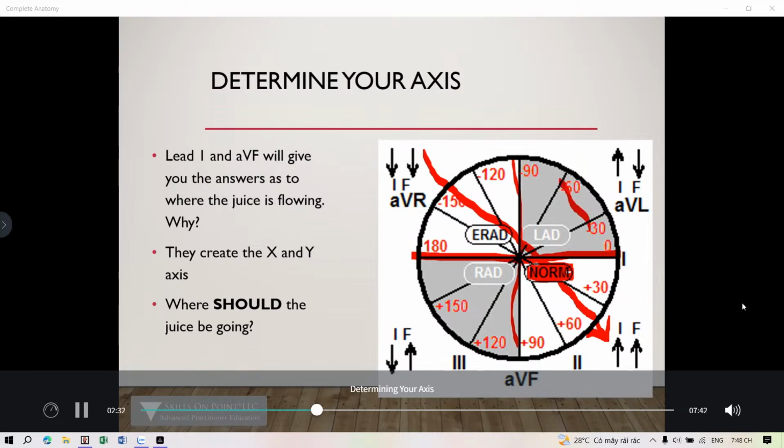So over here, let's say you're on that rightward side of the screen here, but that's actually the patient's left. Let's say your mean electrical axis is this direction, and it's going towards the 1 to 3 o'clock on the screen. So there's a 0 degrees here, and this is minus 90 degrees.